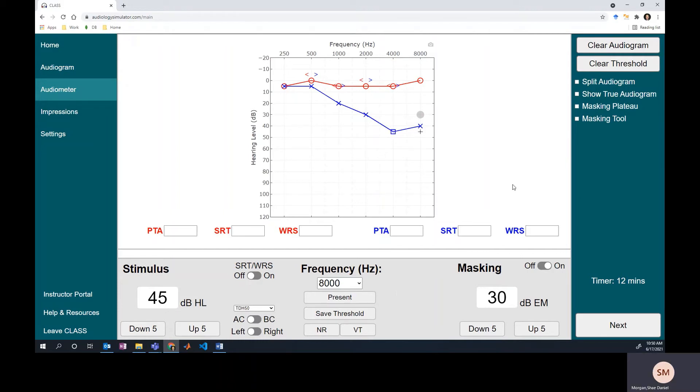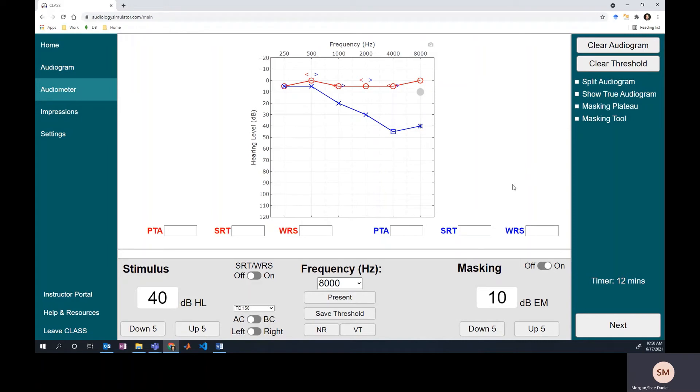Now we'll go over to 8,000 Hz and do the same thing. Let's put masking in the non-test ear air conduction threshold. We'll add our 10 dB safety pad just to feel more confident that we're covering up that ear's threshold. We present and we don't get a response. Why? Because it turns out that before we started masking, the patient responded because they heard the left ear air conduction threshold in their right ear by bone conduction.